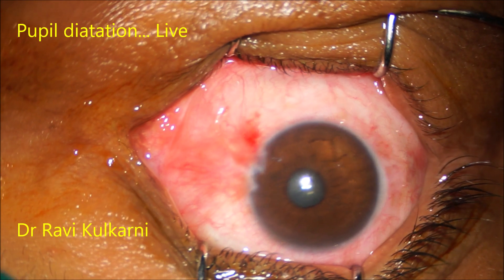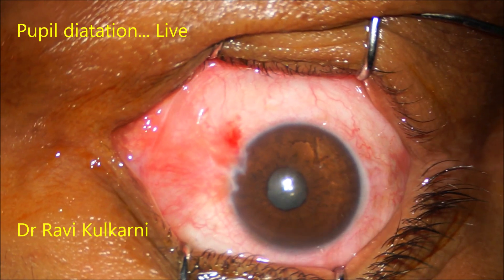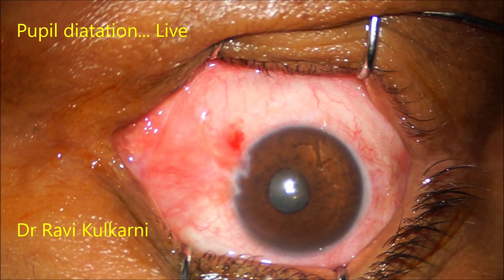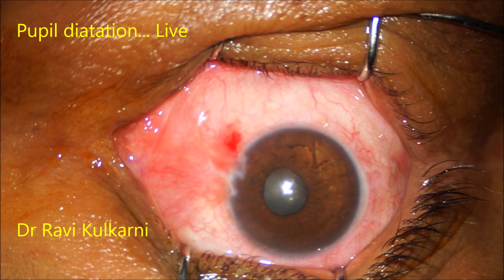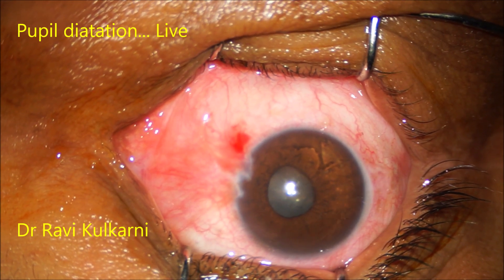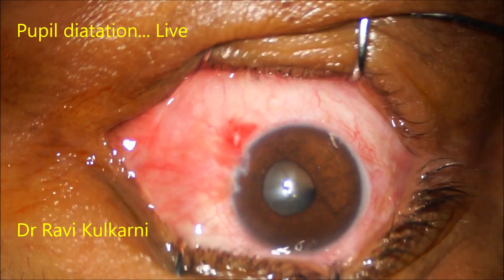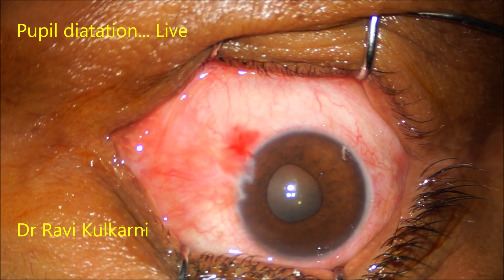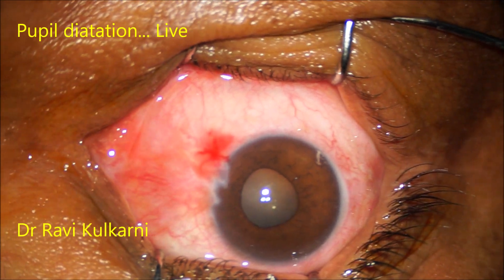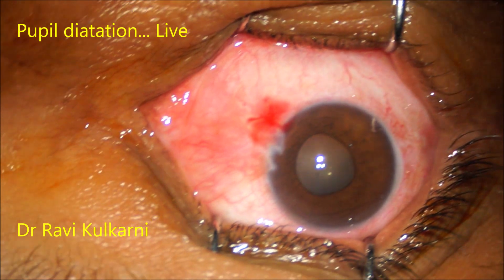Let us see this in normal speed. After injecting the xylocaine with adrenaline, the pupil starts dilating, and in about 10 to 15 seconds, almost 70 to 80% of pupil dilatation is achieved.